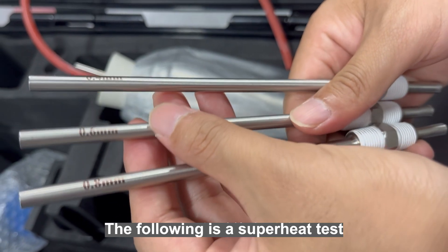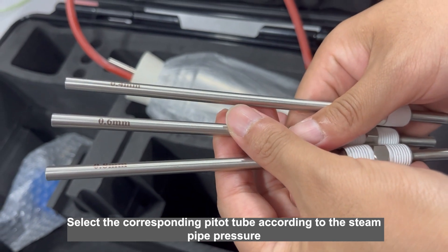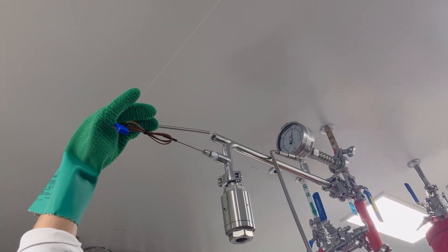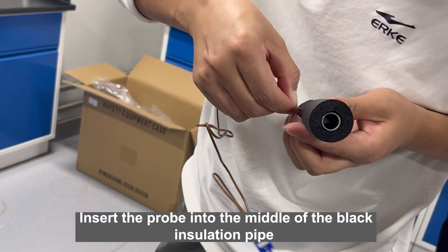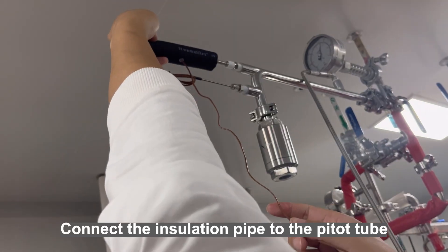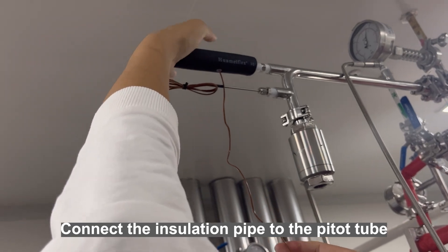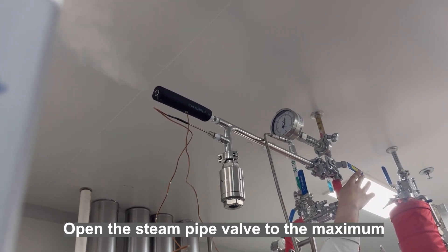The following is a superheat test. Select the corresponding pitot tube according to the steam pipe pressure. Connect the pitot tube to the elbow pipe. Insert the probe into the middle of the black insulation pipe. Connect the insulation pipe to the pitot tube. Open the steam pipe valve to the maximum.